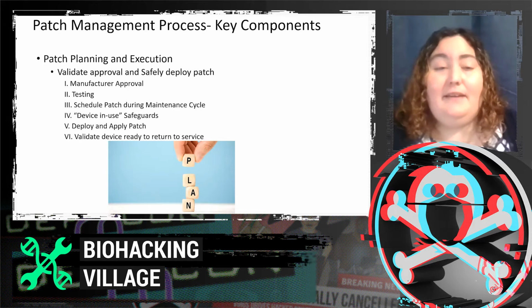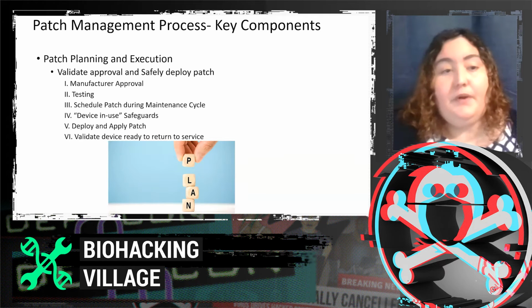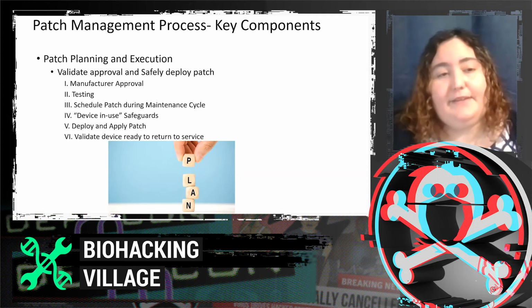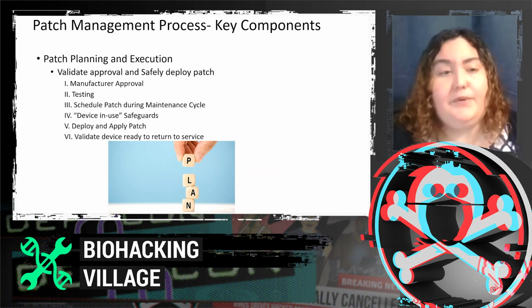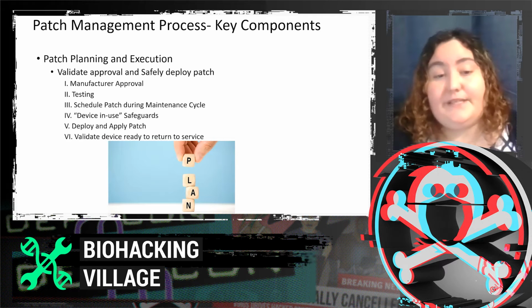You're going to need to plan your patch execution safely. So if you have a test device, you're going to want to, one, receive your manufacturer's approval, and test it on a device that's not in use at all. Verify that it does not in any way impact your workflow, just so that we know it works in your environment. Schedule a patch during a maintenance cycle, so at the time that the device will be down anyways. Use your device in use safeguards that are in your manual. Deploy and apply the patch, and validate that the device is ready to return to service.